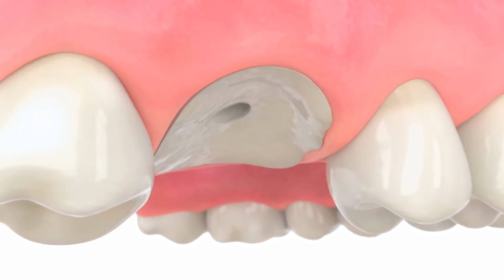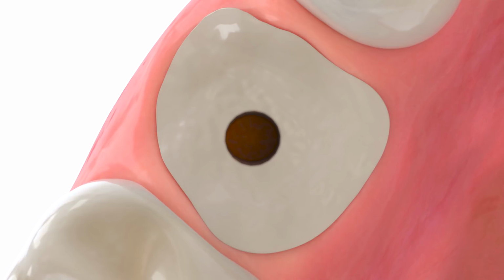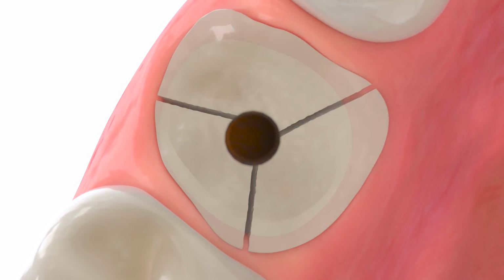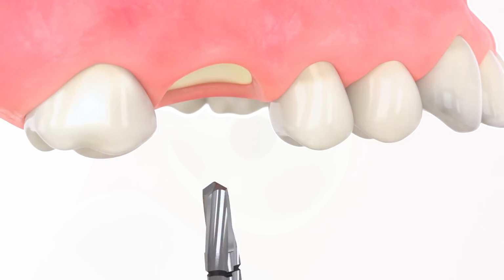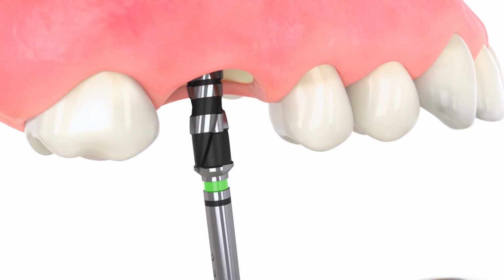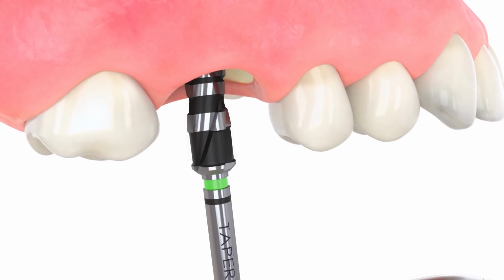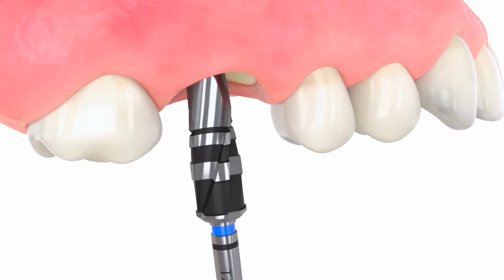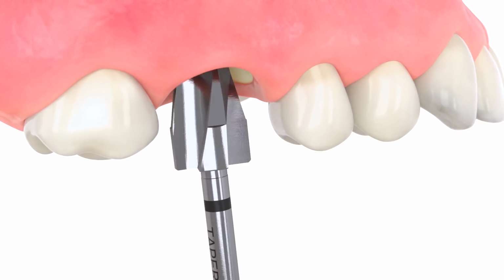Once the osteotomy has been developed as far as possible, split and remove the remaining roots. Continue to develop the osteotomy using tapered HD drills. Complete the osteotomy using the tapered IM length drill.